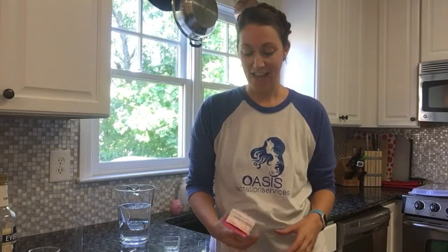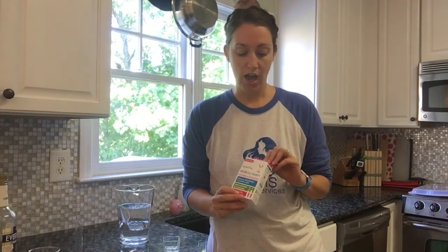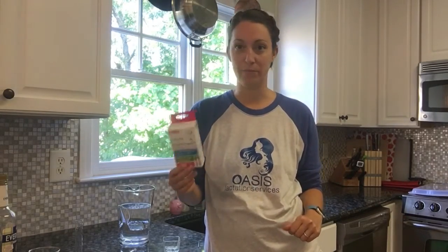Hi, it's Danielle with Oasis Lactation Services, and here is our much talked-about video on Facebook: the Milk Screen breast milk testing strips that detect alcohol in breast milk.